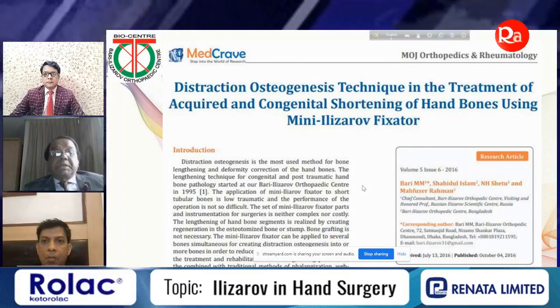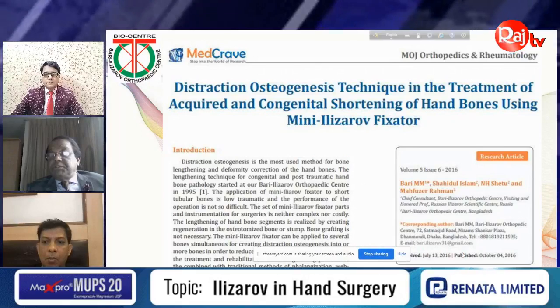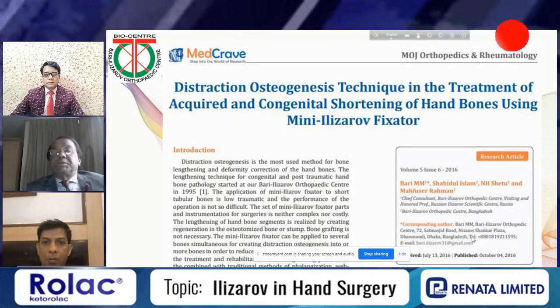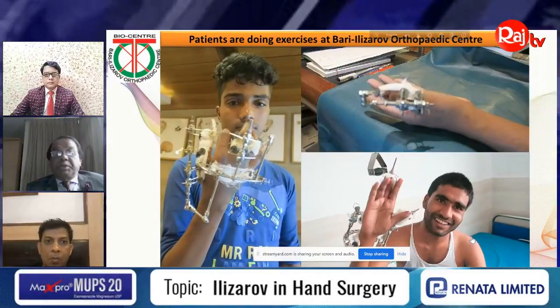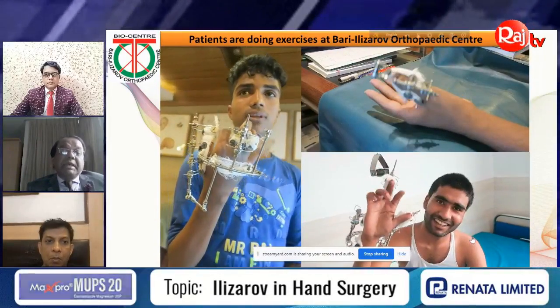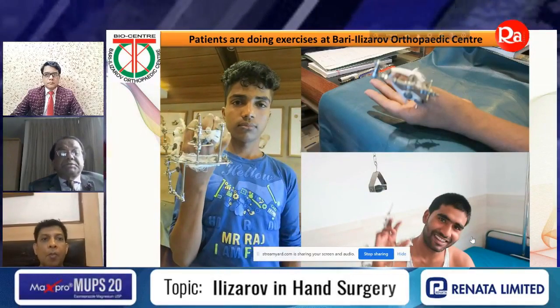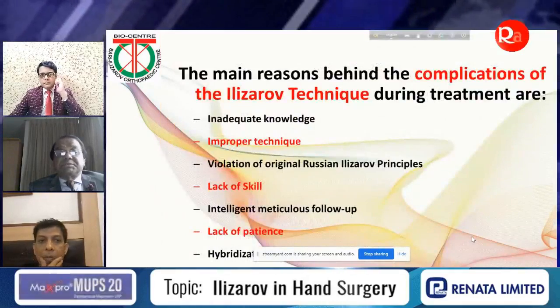See, I have done the cases, and you can see here 2016, 4th October. This is the publication in MedCrave journal. Whenever you put Ilizarov in the hand, the patient can do any kind of exercises, and the healing process will be very good when you advise your patient with the fixator to go for exercises.